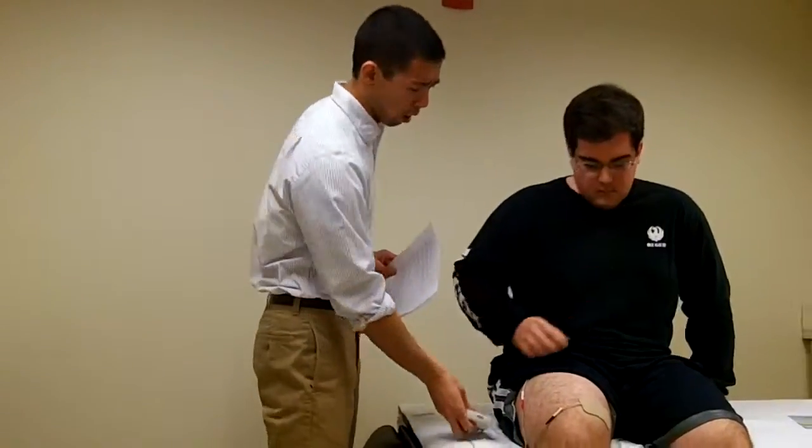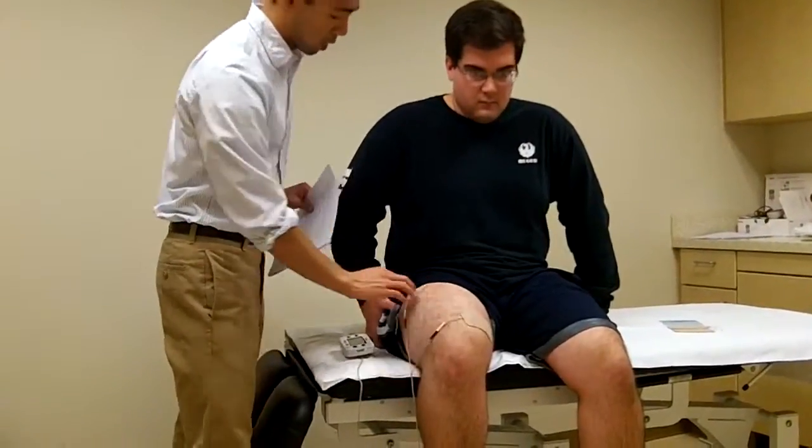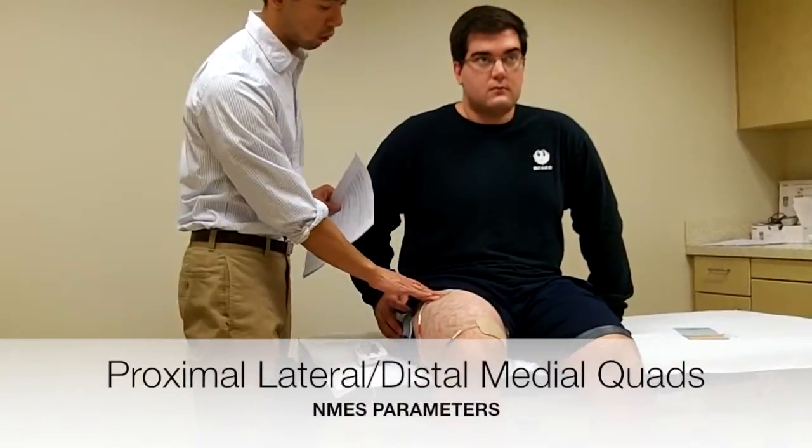The placement of the pads was the distal medial quadricep and then the proximal lateral quadricep, right at the insertions of the quadricep muscle.